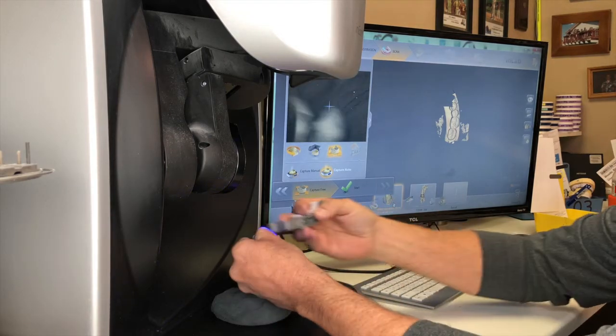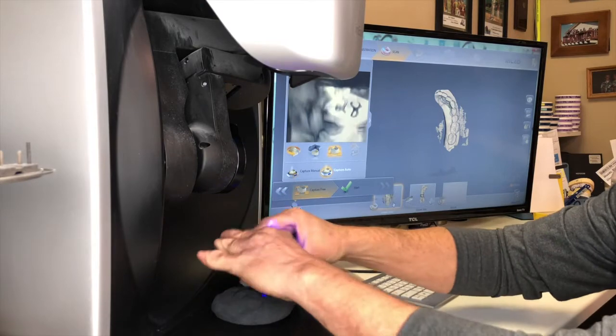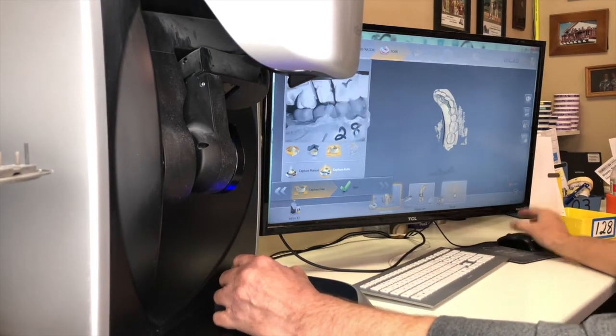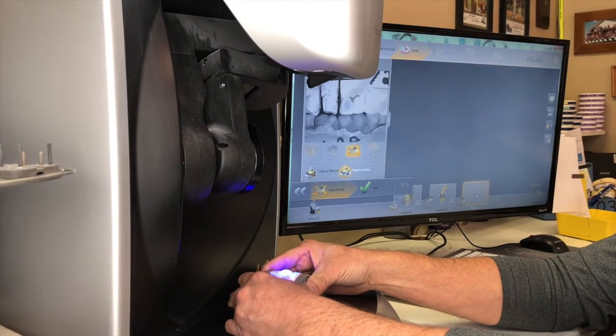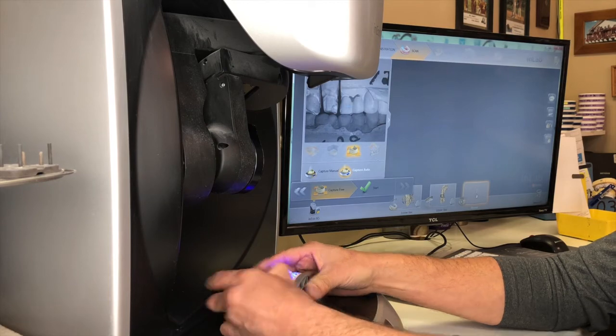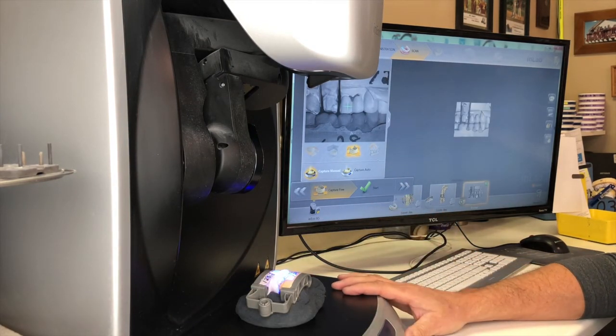Then I will put my models together so I can take my final shot, which is one shot of the buccal bite. While I'm moving, I'll come over here and choose the buccal catalog, set my model where I need to — that's my final shot. Press the button one last time. So that's your Tech in Two for today. Thanks.